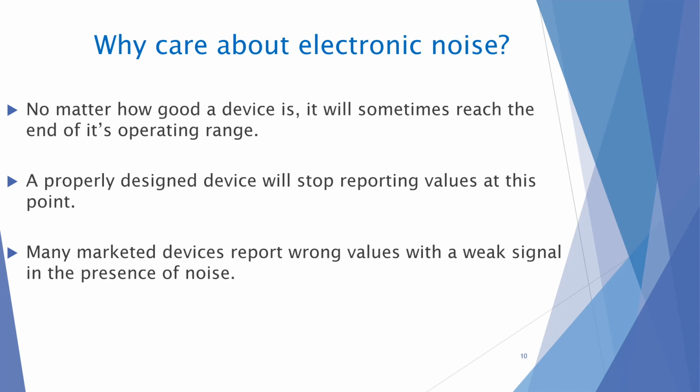The Masimo algorithm, because it uses a very, very smart thing called the SAT transform, where one of the fundamental assumptions is that the venous SAT is lower than the arterial SAT, will sometimes, when there's a lot of noise there, pick up on noise at a high SAT and report that value, because it thinks the other stuff that's going on is the venous SAT, which in some cases is the patient's real SAT when it's in the 70s.